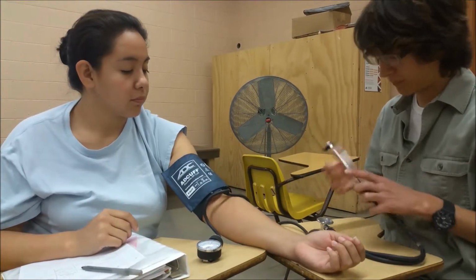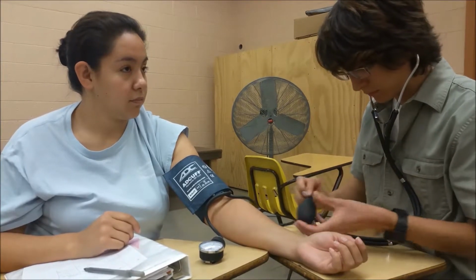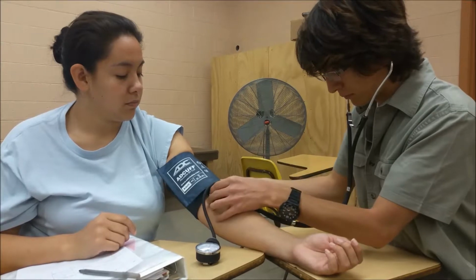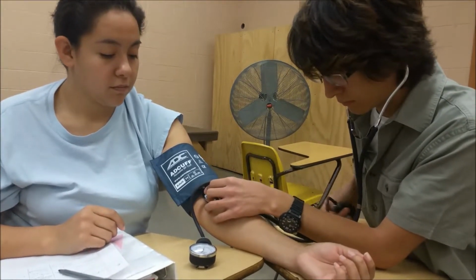Using either the bell or diaphragm side of the stethoscope's chest piece, place the chest piece below the antecubital space over the brachial artery. Make sure that when you are using the stethoscope to hear, the prongs are facing forward when wearing it.